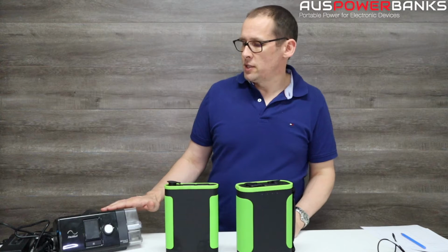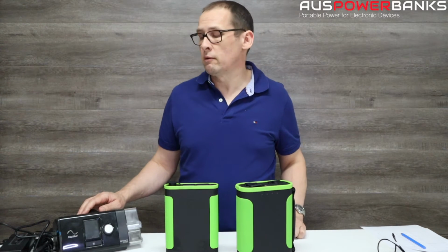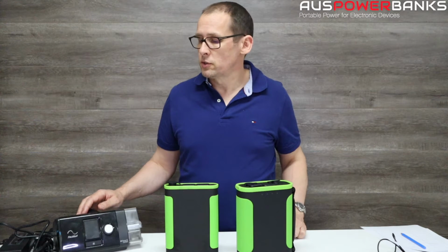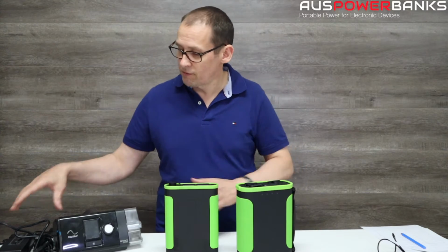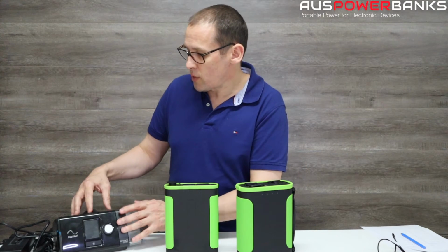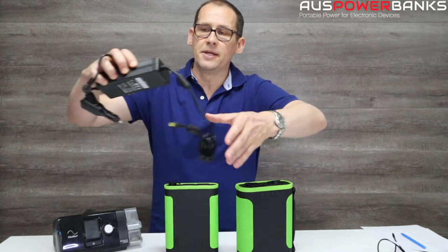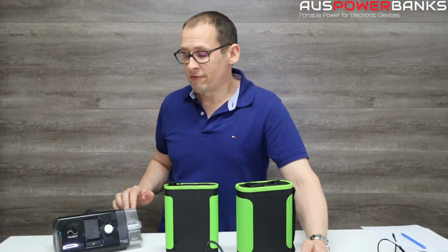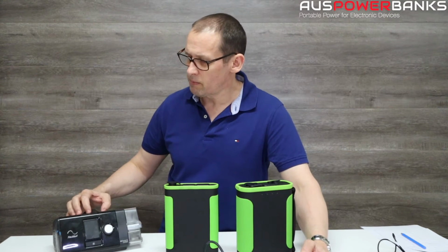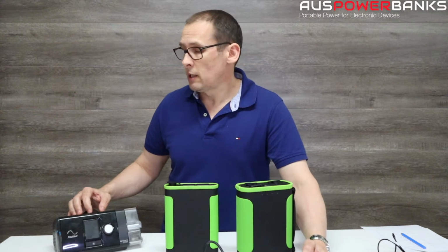Most manufacturers of CPAP machines will offer a 12-volt charging function. So as well as your 240 volt into the wall, you can get a 12-volt option. For example, I've got a ResMed CPAP machine over here, and ResMed offer basically this setup. Now this CPAP machine has a humidifier and also a heater built into it, so it's a little bit more high spec than a lot of CPAP machines. The voltage on it is a little bit higher as well.